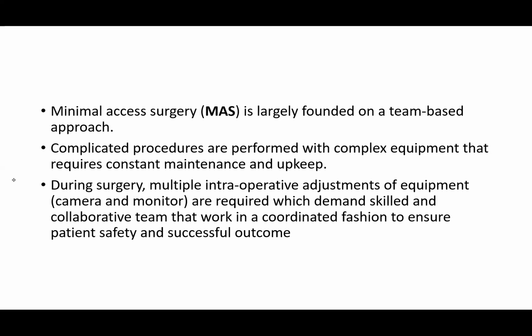It's practically impossible. So you must go along with your team. The peri-operative nurses are very important. The biomedical engineers are very important, as well as your assistants. So each and every member of the team must understand what is going on.